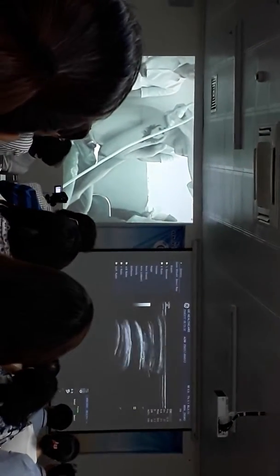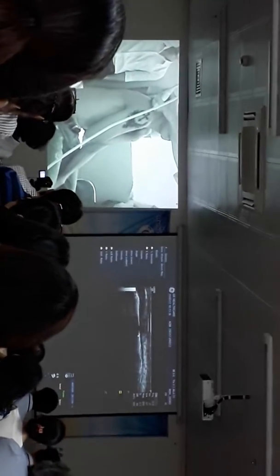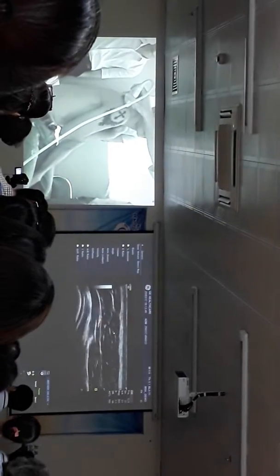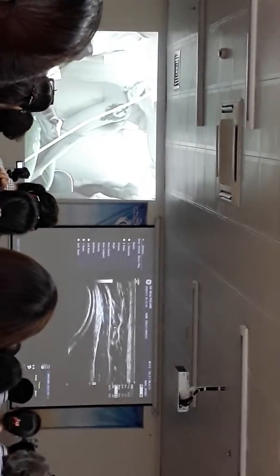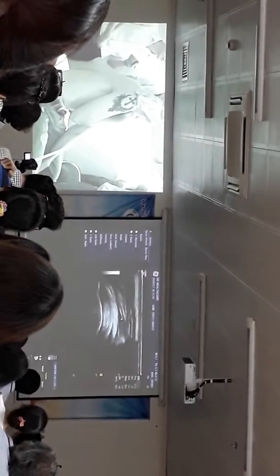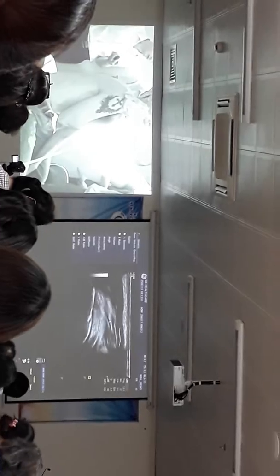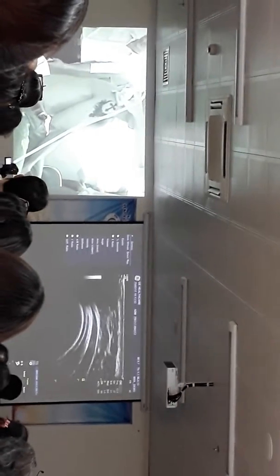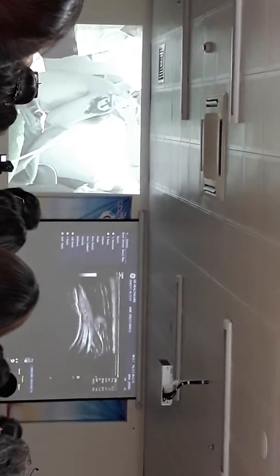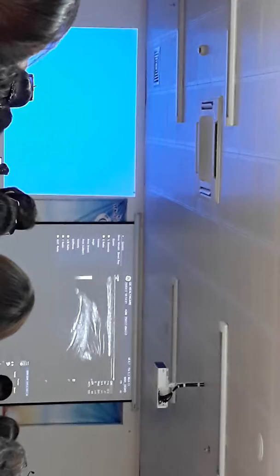So from here, we just start around. This is the bony spine of the scapula. If you slide slightly inferior, and then rotate anteriorly, you come into the musculotendinous junction of the infraspinatus, and then this is the infraspinatus tendon just here, following it to its insertion on the greater tuberosity.